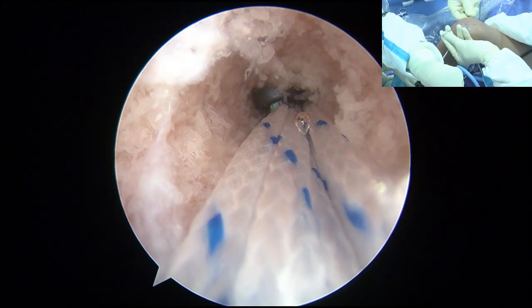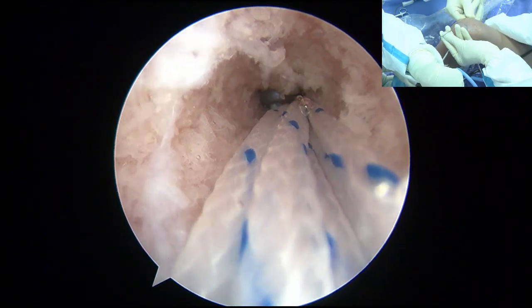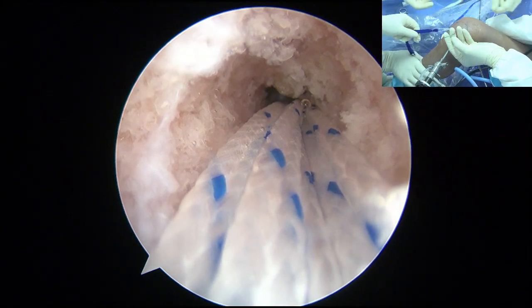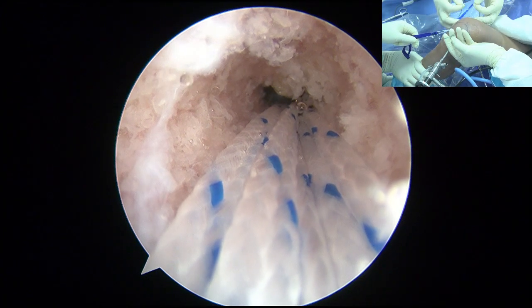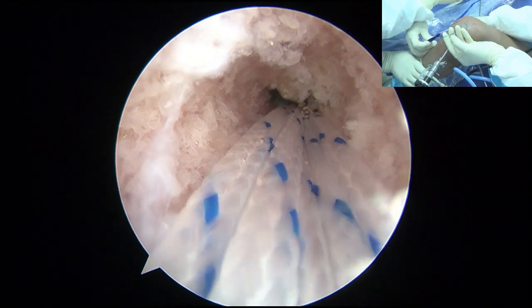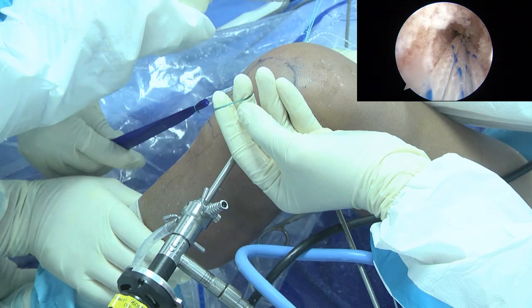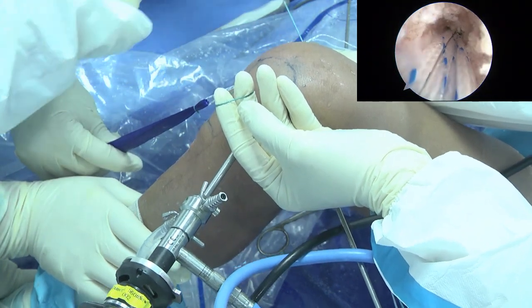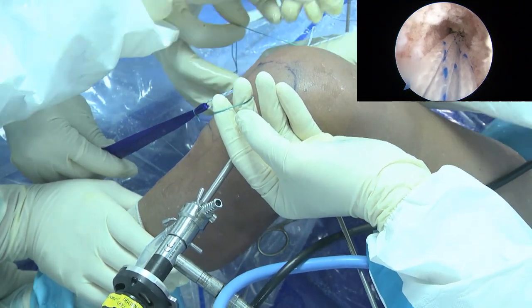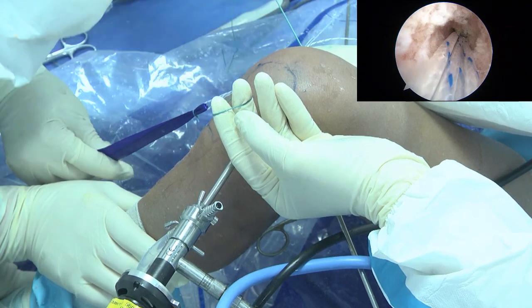The problem of the PCL is many times you pull the button too deep. It's more common than ACL in my practice. So sometimes it's getting out, right? So now you flip. 因为PCL的股骨侧隧道是比较长的. First you slide the suture. When you slide and you feel there's no resistance, that means the button is outside the bone. If the button is inside the bone, you can feel some resistance. 把体外的线呢拉一下看一下有没有阻力，就可以判断. You slide both sutures. And then you flip. 出来了没有? Take these two sutures and flip.